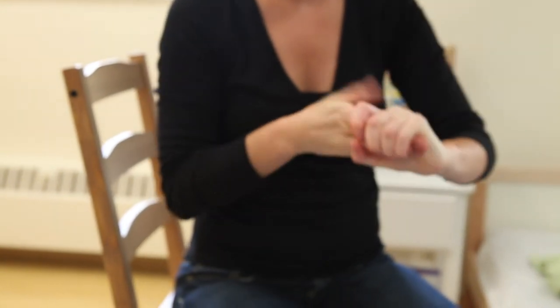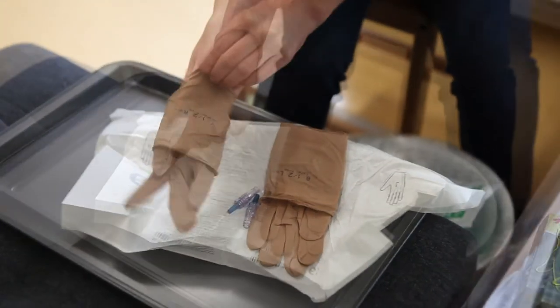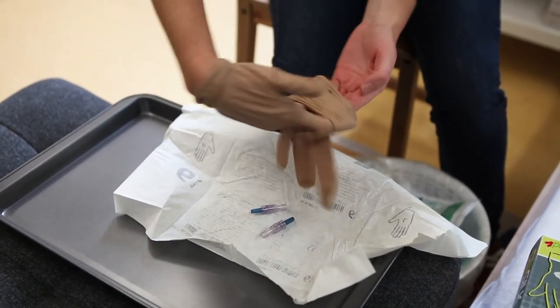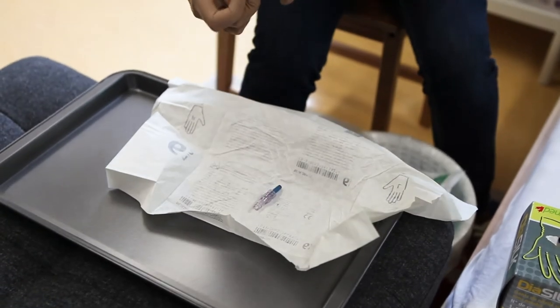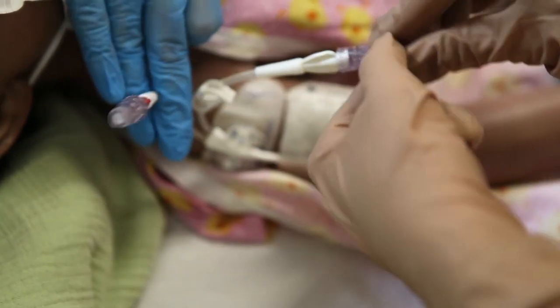Perform hand hygiene again, then put on your sterile gloves using the appropriate technique. For instructions on how to properly put on sterile gloves, please watch the video on the sterile gloving procedure. With your sterile gloves on, carefully pick up the new cap, remove the old one, and apply the new cap securely.